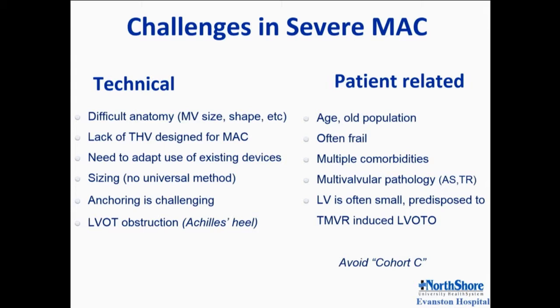Sizing of the mitral annulus in the presence of severe MAC is very difficult. There's no universal method. We'll talk about the CT sizing in a moment. Anchoring for balloon expandable valves is very challenging because we rely on the calcium only. So we are limited by the amount and distribution of calcium and factors that we'll discuss. And LVOT obstruction, obviously, is the Achilles heel of this procedure.